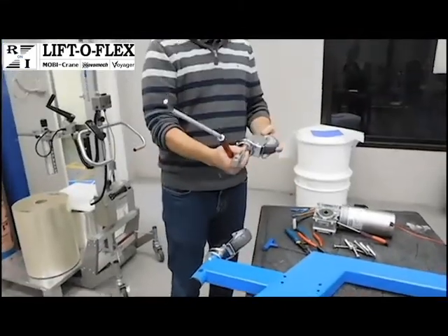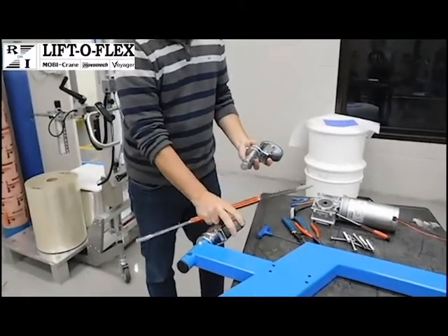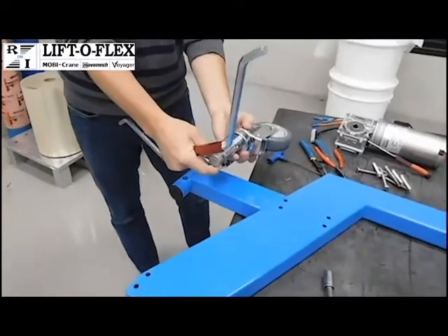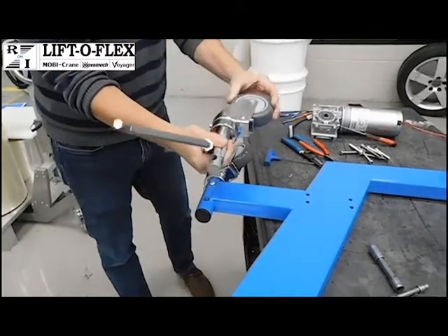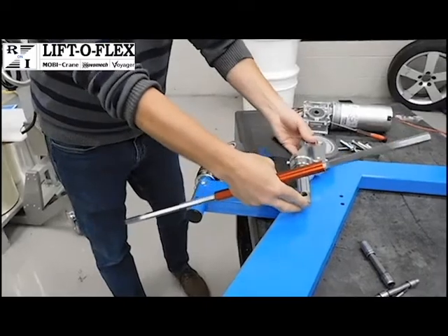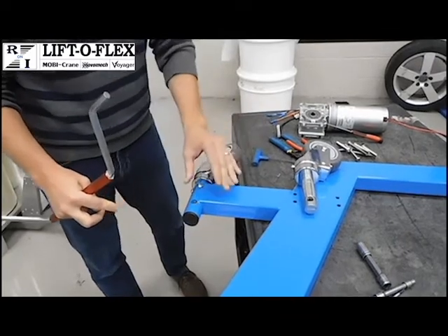So the spare caster has to be prepared in the same manner. And as we brake the wheel in the lock position, the caster needs to be in the same orientation, and the brake has to be engaged on the replacement caster, so now it's locked. What's important is that this caster stays in this orientation so that the hole that the brake rod goes into stays in the same pattern as the leg.